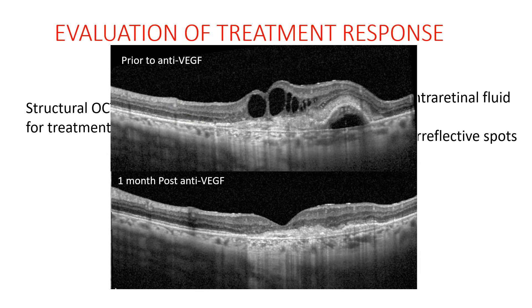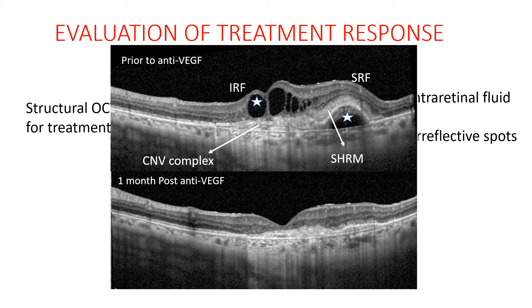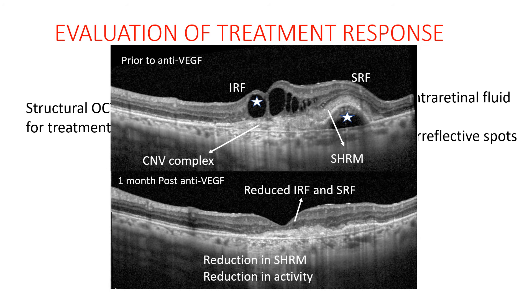Here we can see the above image is of structural OCT prior to anti-VEGF injection, where there is evident intra-retinal and sub-retinal fluid, sub-retinal hyperreflective material, and the CNVM complex. One month after giving anti-VEGF injection, there is evident reduction in both intra-retinal and sub-retinal fluid, reduction in sub-retinal hyperreflective material, and thus reduction in CNV activity.